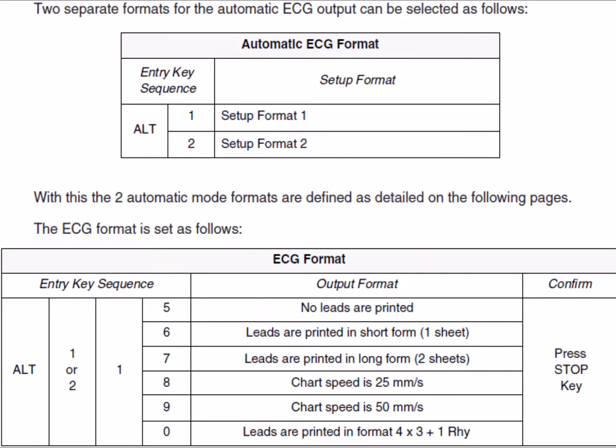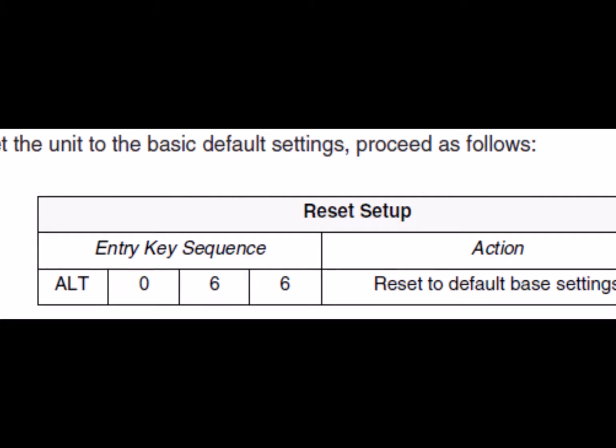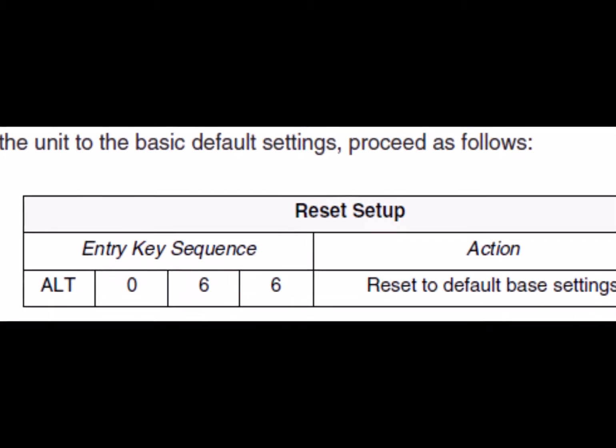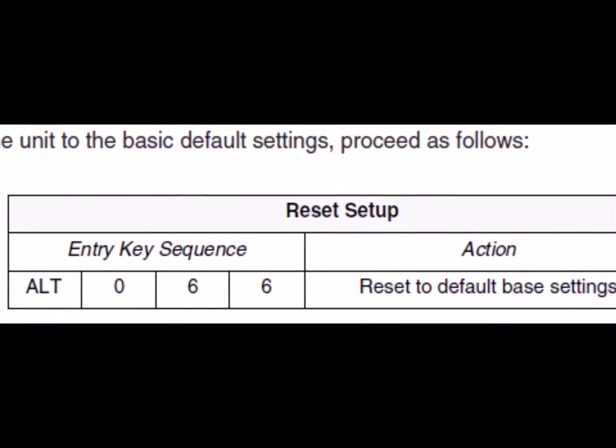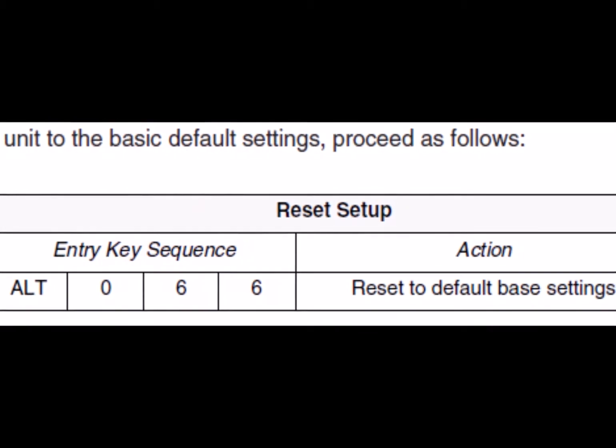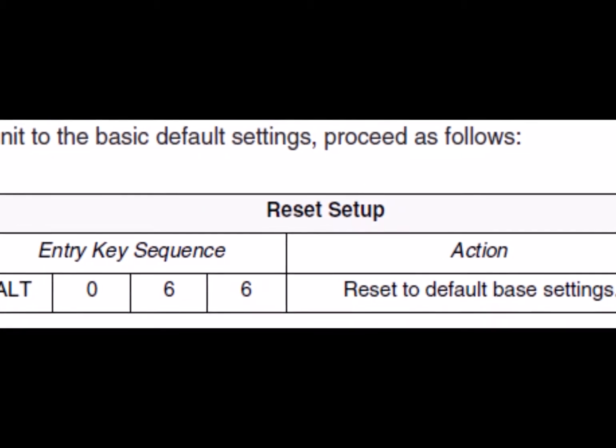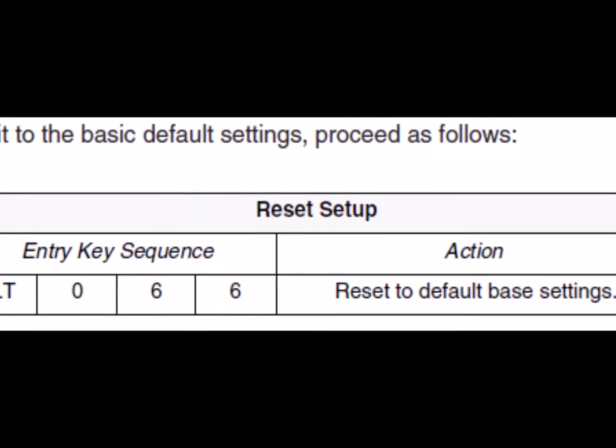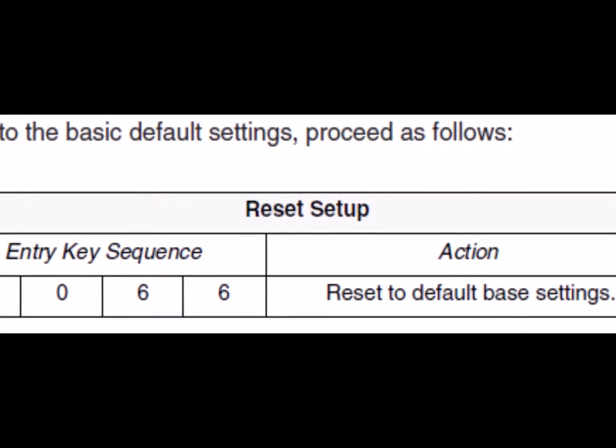There are two printout formats that can be pre-configured in the AT2. These are the corresponding codes to define what will be printed out on each. In order to reset the unit to the basic default settings, press the ALT key followed by 066 and confirm by pressing stop.